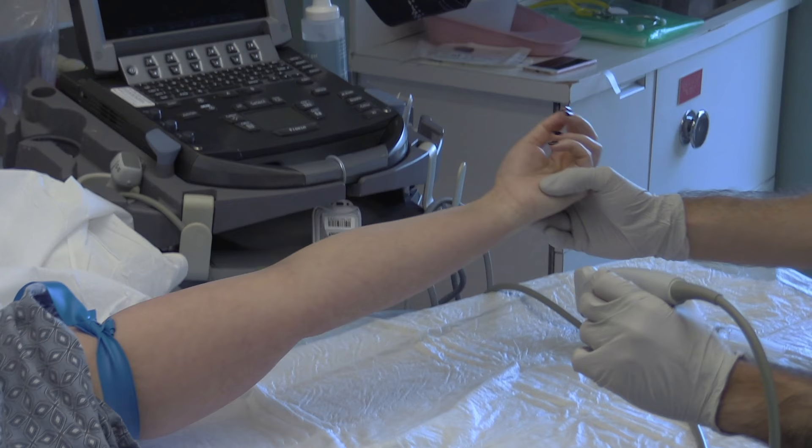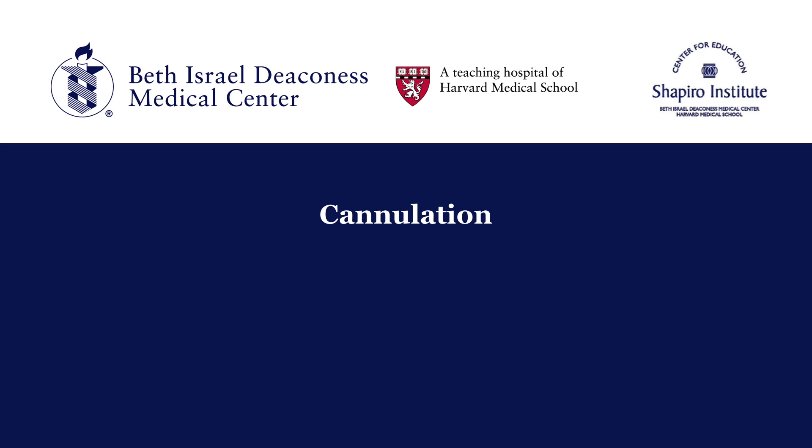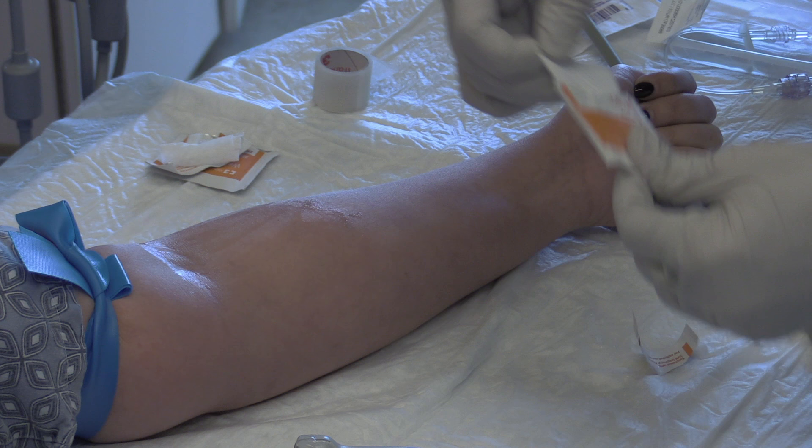The next step is positioning, which is one of the most important steps. We show suggested positioning using a side table. Abduct and externally rotate the arm for easier access to the basilic vein. If you're new to the procedure, it can be helpful to place a chucks under the arm to minimize mess. Be sure the bed is at a comfortable height and all materials are well within reach, arranged in order of use. Attach your flush to the IV connector tubing and flush the tubing. Take the cap off the end for easier use and rest it inside the initial packaging to keep it clean.